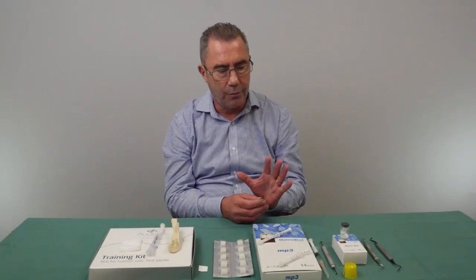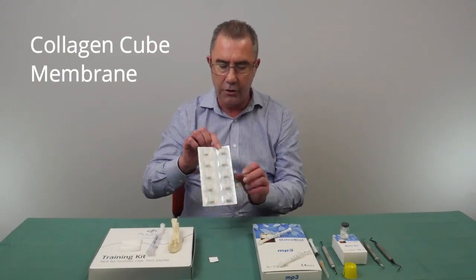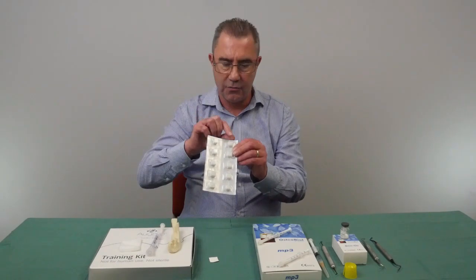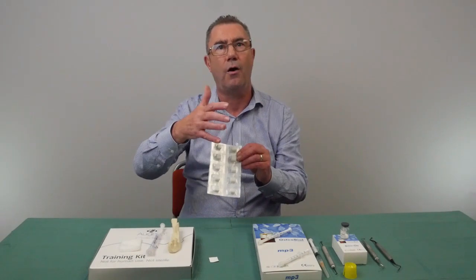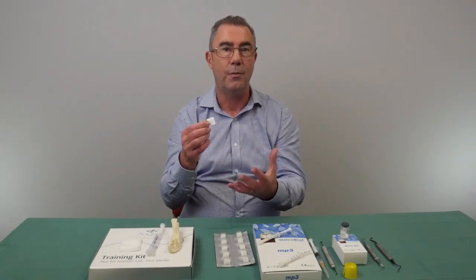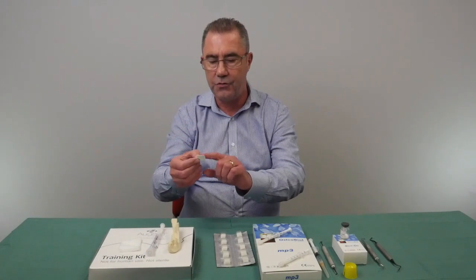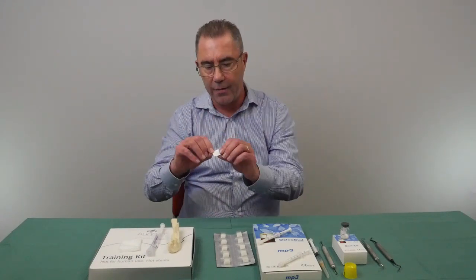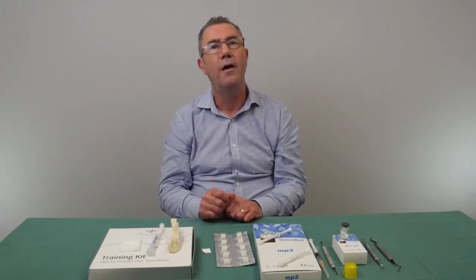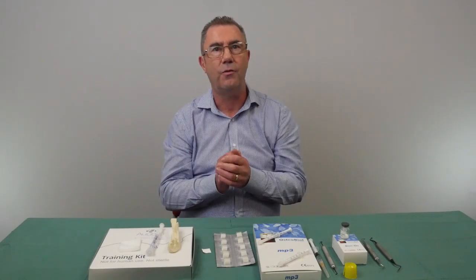The next step is to use something like a collagen cube or a membrane to seal the material in place. The collagen cubes come in packages — you open the packet, take out the cube, and it can be compressed slightly. It's made of collagen and forms part of a blood clot over the top of the bone material. Alternatively, you can use a resorbable membrane, which will break down and disappear over time. Membranes have two sides: a rough side that goes towards the socket, and a smooth side facing the overlying mucosa. Whichever option you use, it's important to then seal the mucosa over the top using a suture.